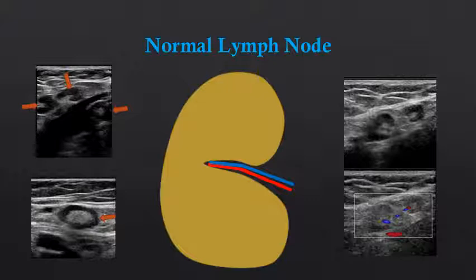The cortex can be a variable thickness, and the fatty hilum can be large or small. But there is a consistent orientation, and often hilar blood flow is detectable.